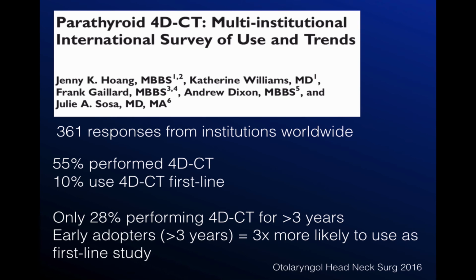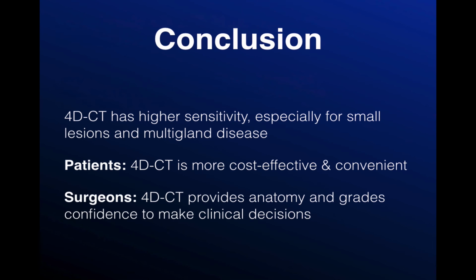I'm going to conclude now, and I'm going to say the first thing is that the choice of modality is really institution dependent, and there may be an institution that is a lot stronger with scintigraphy, and in that institution, that should be the imaging study of choice.